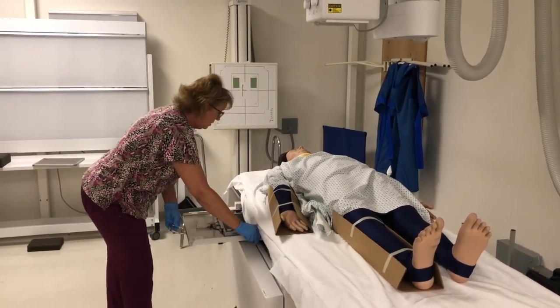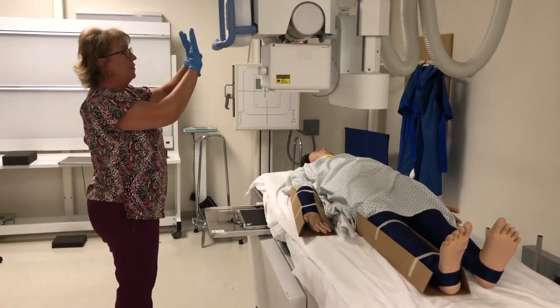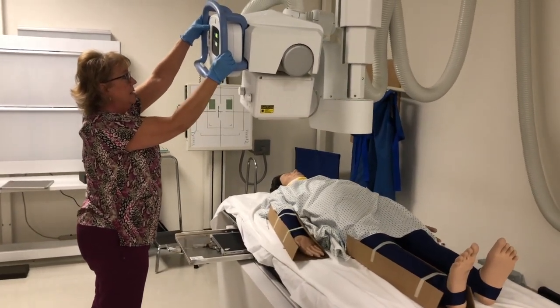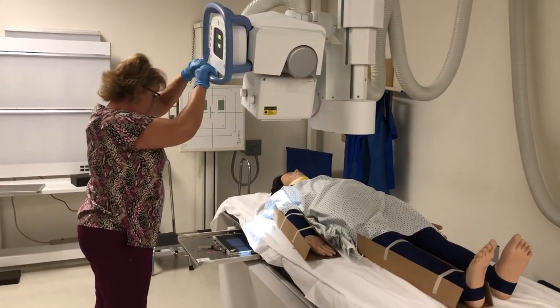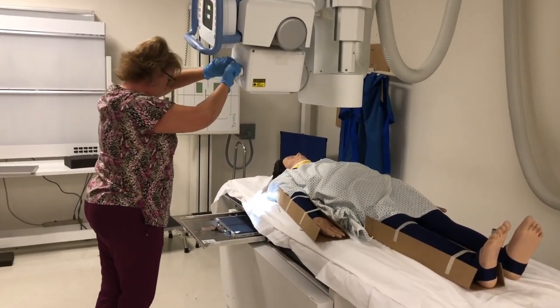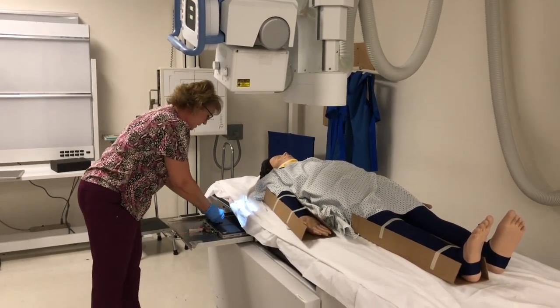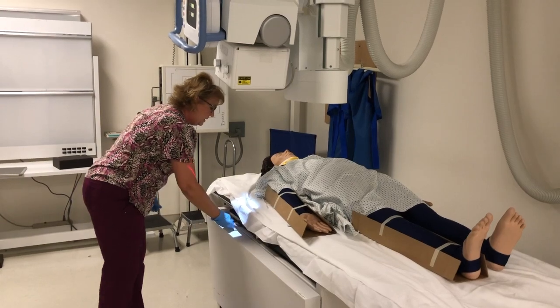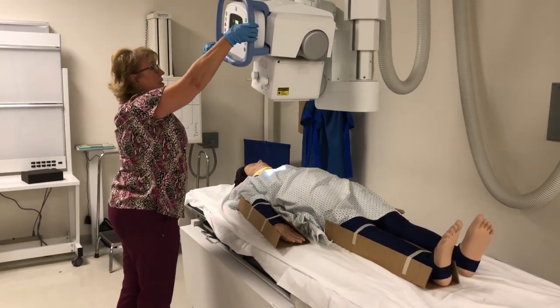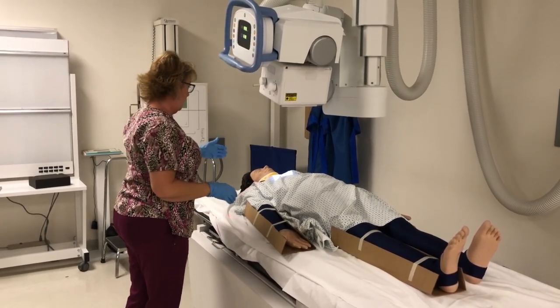So we're going to start with our AP C-spine. And again, if I'm by myself, I've still got these gloves on, but I'm going to wipe everything down when I'm finished. All right, so I would set up as we talked about for the C-spine already. Placing my right marker and continually assuring the patient that we're moving as fast as we can. Let us know if something hurts. You want to keep an eye on the patient.